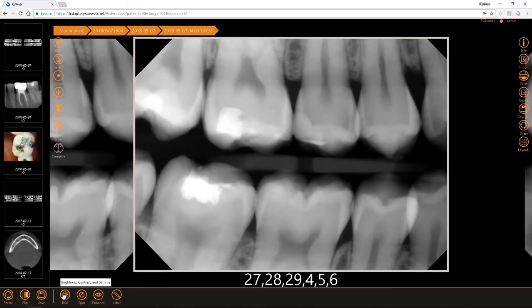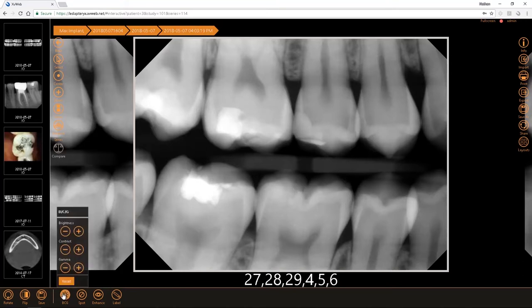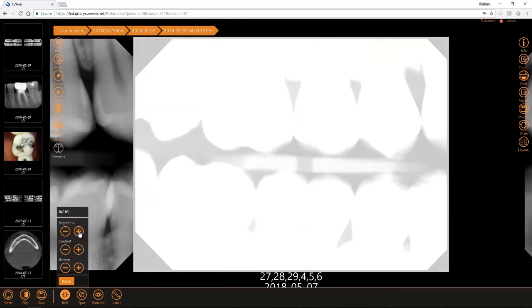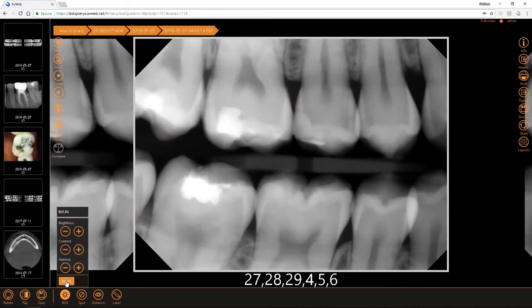You can adjust your brightness, contrast, and gamma. To do so simply click the button and you have a plus and minus for all three functions. At any time you can click reset to get back to a starting position. Please remember the brightness and contrast adjust all the levels in the gray spectrum, where the gamma keeps the top and bottom of the spectrum stationary and dynamically changes the grays in between to give you a little bit better control on your contrast.